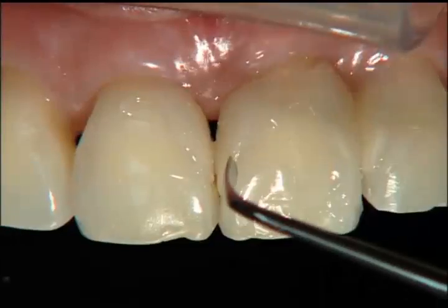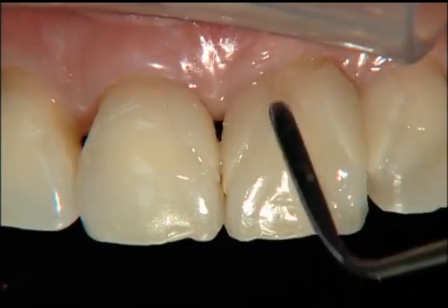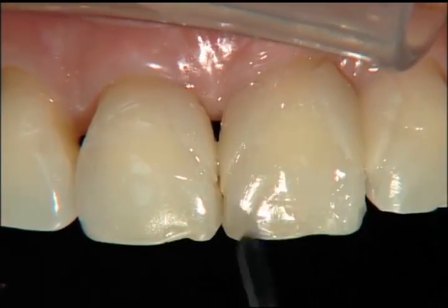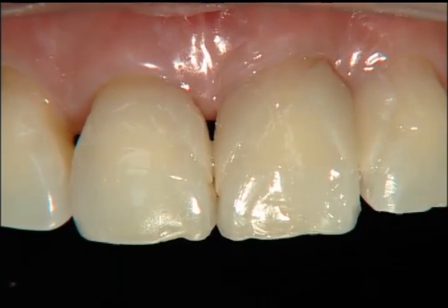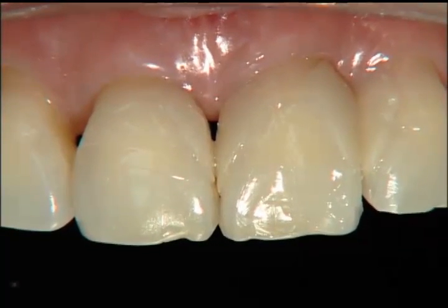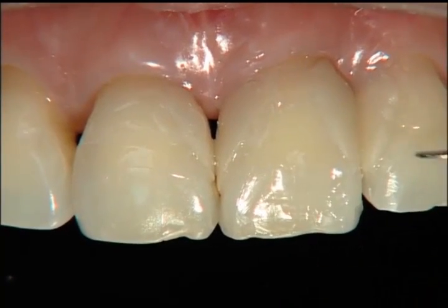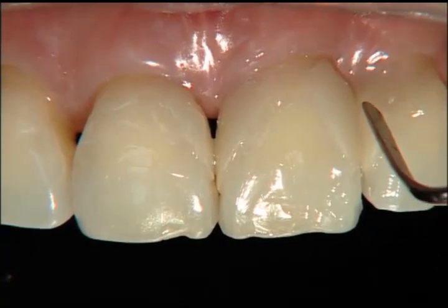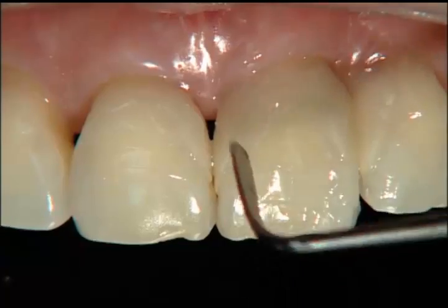Taking an instrument and pushing these around a little bit, just trying to see where they fit the contour of the teeth the best. You want to get an idea and memorize it so that when you place these porcelain veneers with the real cement, you're able to do the same maneuvering and end up with these pieces in the same place. After we cure these, we're going to finish the margins down. The patient approves of how these look.